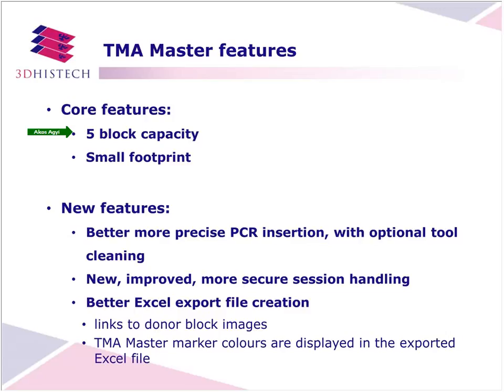The big advantage of the TMA Master is that it's a small footprint benchtop machine which fits really well in every research laboratory. Our TMA Master users also can enjoy some new and really helpful features. For example, now a more precise PCR insertion with optional cleaning is available.